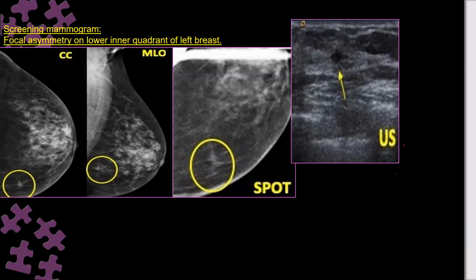By location. Any suggestion? For lesion, there is one view we use for triangulation and lesion localization. Which view? We said, even when we discussed mediolateral, straight lateral view.